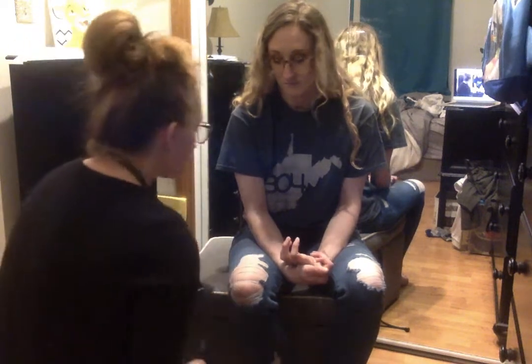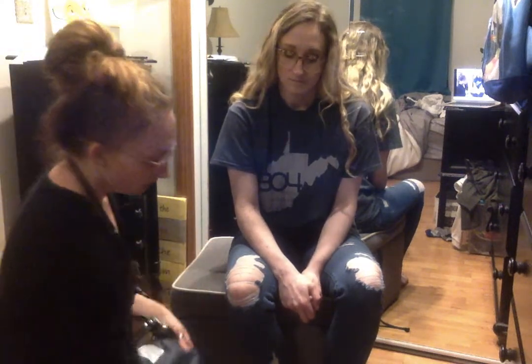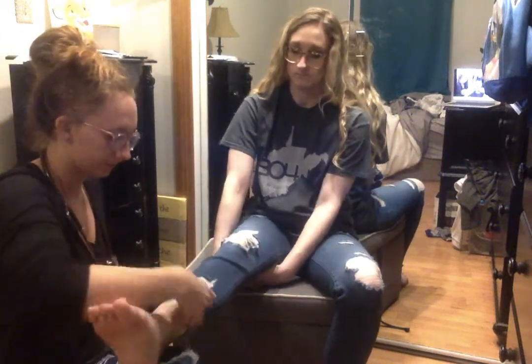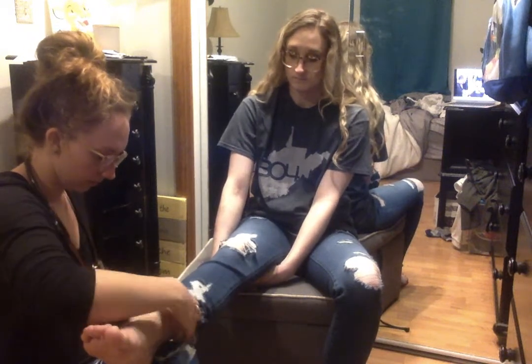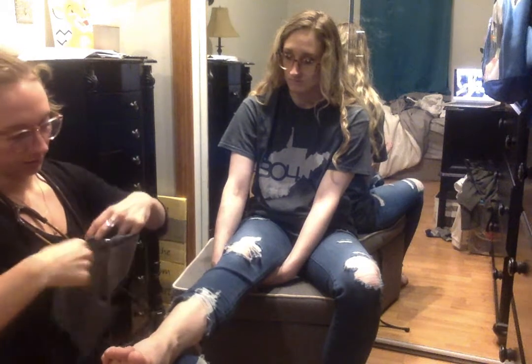So I'm going to start with her right, and since we already did the right, I got 120 over 80, so I would take that top number, 120, and that would be my bottom number for my calculation. And then to get her ankle pulse, I would have to, well, I guess we can just try this, and then I'll explain it for the other side.